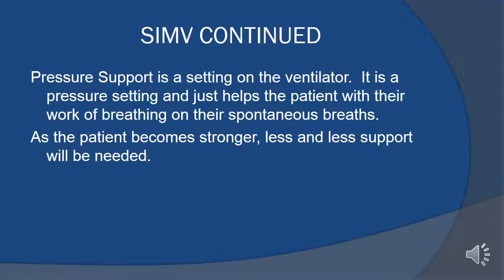So pressure support is a setting on the ventilator. It is an actual pressure support setting that just helps the patient with the work of breathing on their spontaneous breaths. Okay, so think about this.